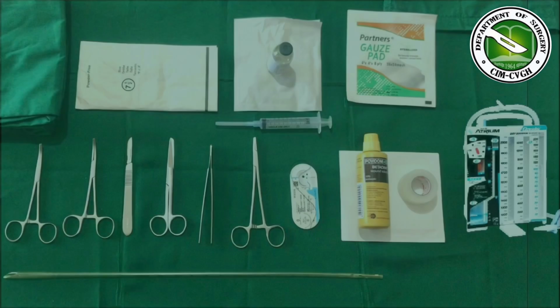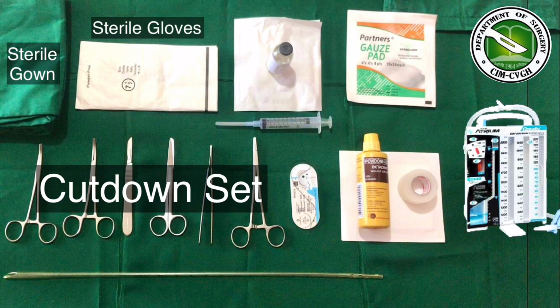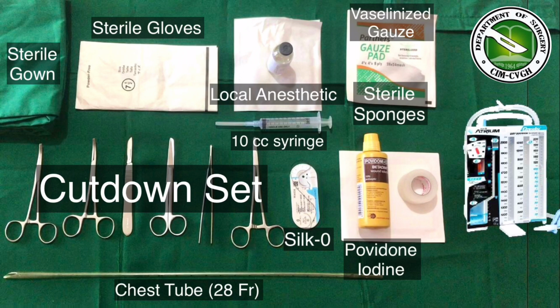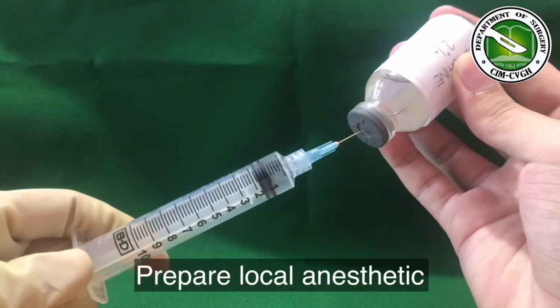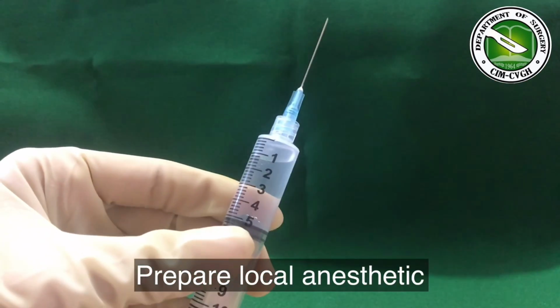Materials needed: sterile gown, sterile gloves, cut-down set, French 28 chest tube, Silk suture with curved cutting needle, 10cc syringe, local anesthetic, vaselinized gauze, sterile sponges, povidone iodine antiseptic, plaster, and underwater sealed chest drainage system. Prepare the local anesthetic and make sure to observe sterility. Remove the bubbles by tapping on the syringe.